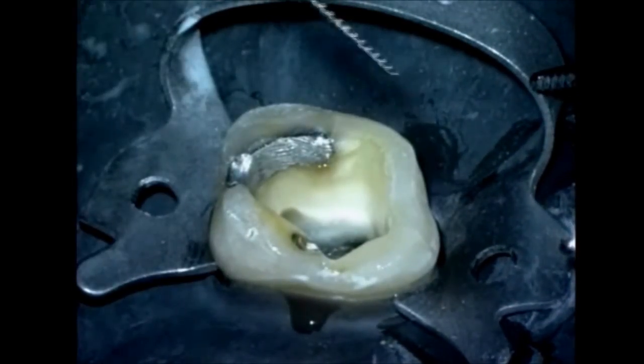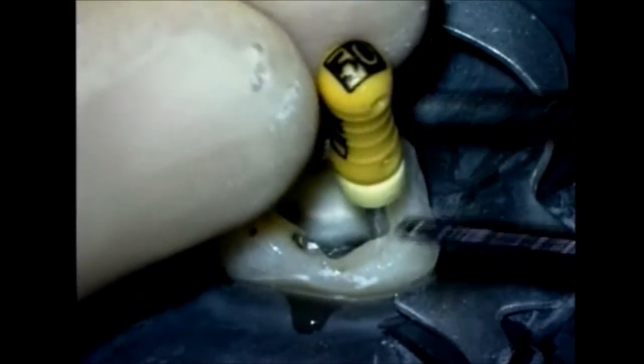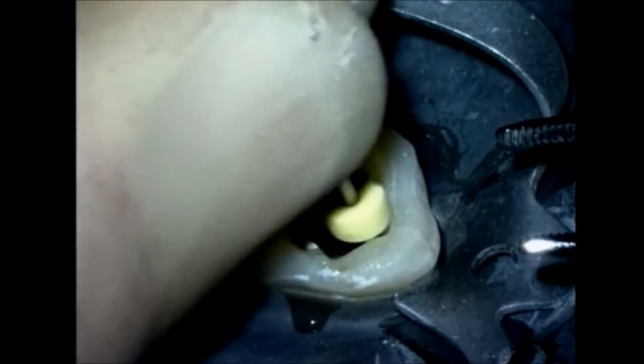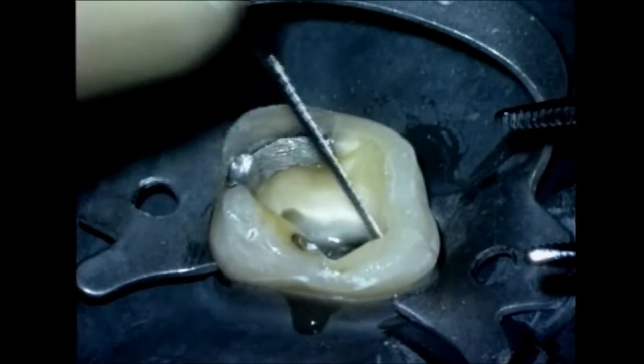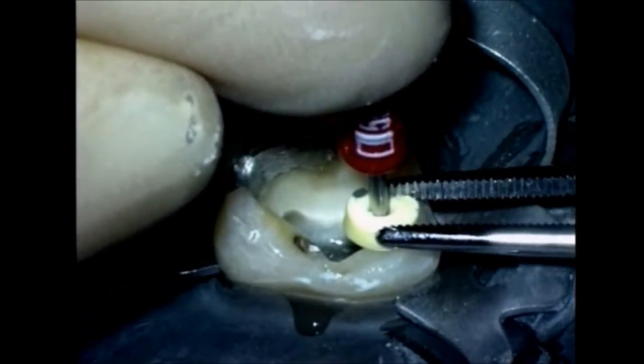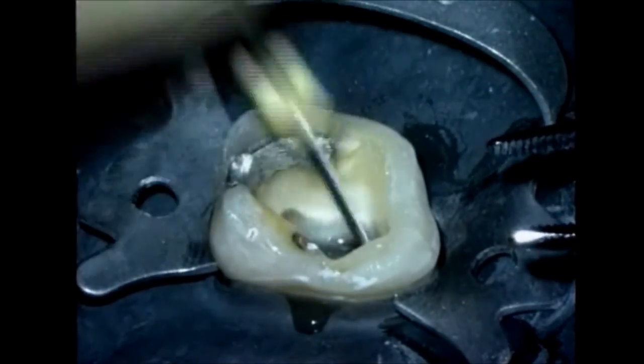To confirm deep shape, we proceed on through the series of hand files. Deep shape is confirmed when each larger sequential instrument is observed to progressively and uniformly back out of the canal. Deep shape creates a more effective reservoir of irrigant and provides the resistance form to hold gutta percha during three-dimensional obturation. The 60 is the last instrument used.